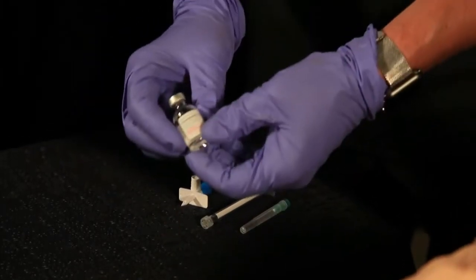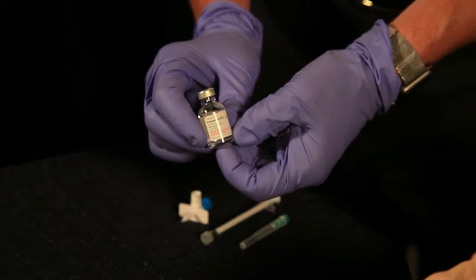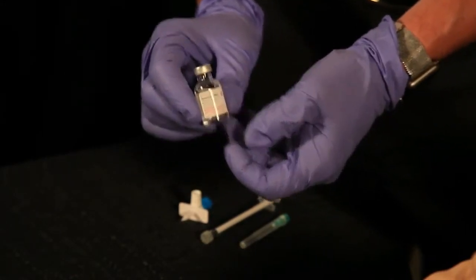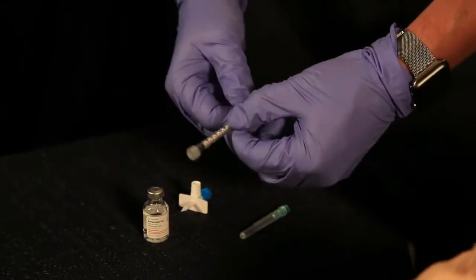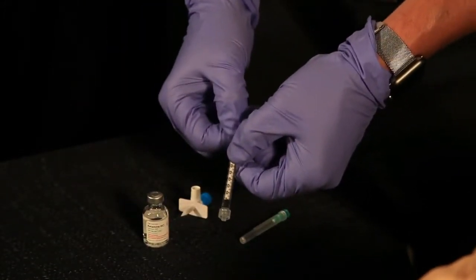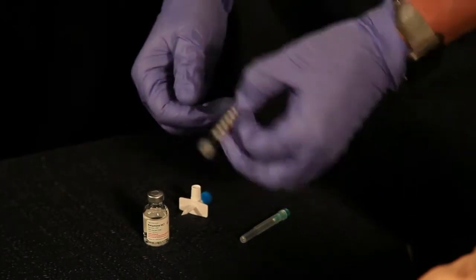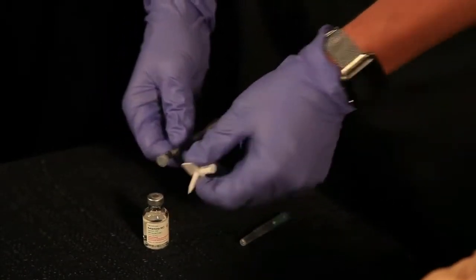So as you look at our vial here, there's 5 milliliters, contains 500 milligrams, and it's 100 milligrams per 1 ml. So what that means is we're always going to use a 1 cc syringe with the Luer lock, and we're only going to pull up 0.25 mLs of ketamine into the syringe. So I'm going to go ahead and show you that procedure real quick.